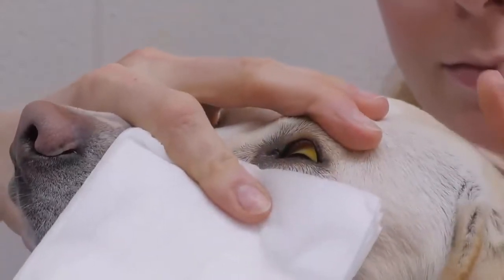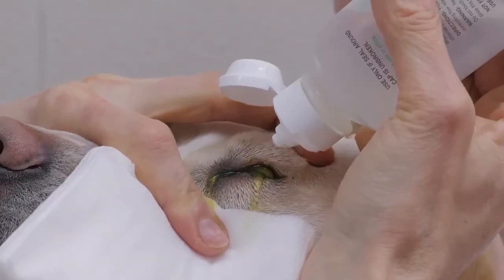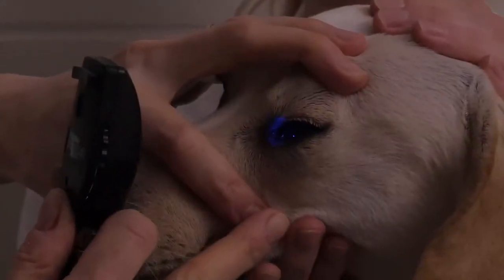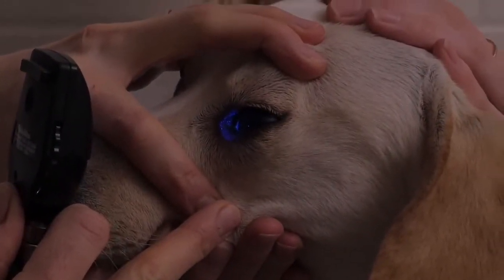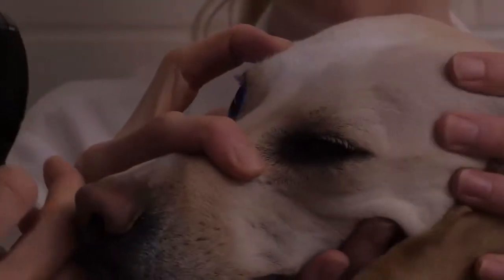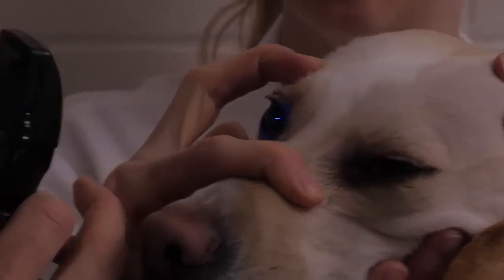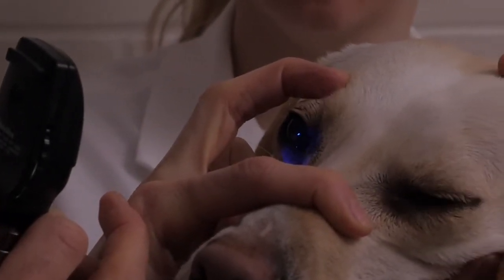With either method, it is then recommended that the fluorescein dye be immediately and vigorously washed away from the surface of the eye with sterile eye wash. The surface of the cornea and conjunctiva are then examined in a totally dark room with a cobalt blue filter on the ophthalmoscope or a Woods ultraviolet lamp. This light promotes fluorescence, which enhances the clinician's ability to identify small corneal or conjunctival ulcers.